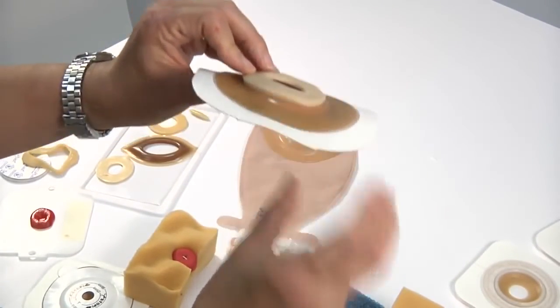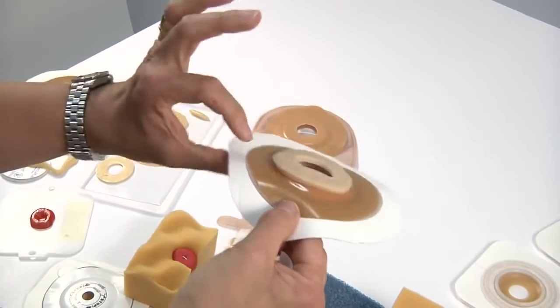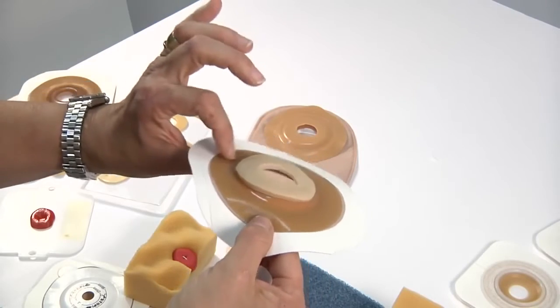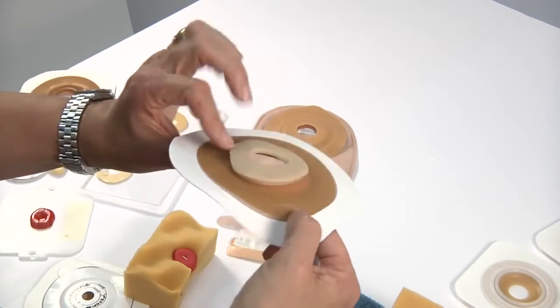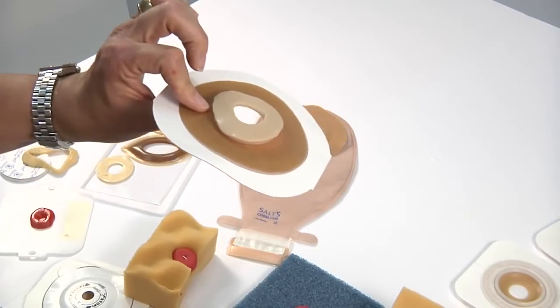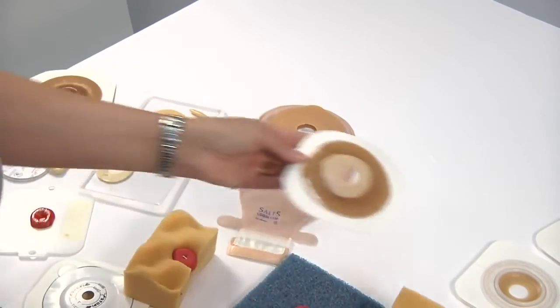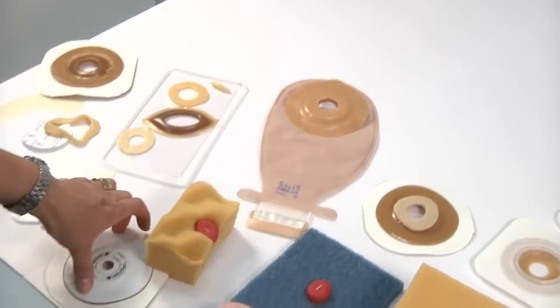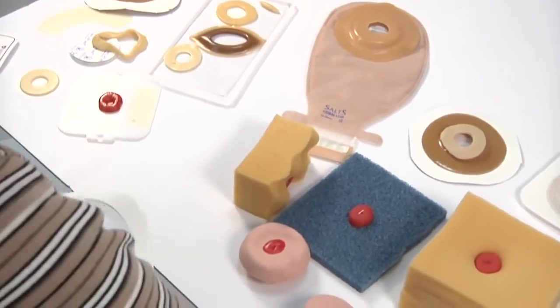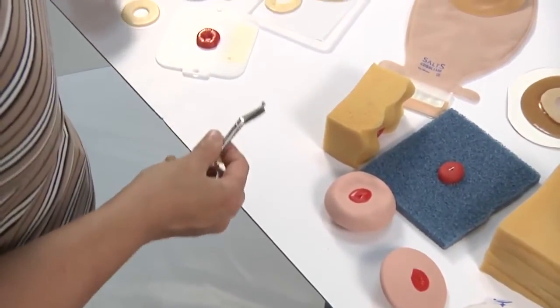Okay? As soon as you do that, though, you're adding cost, right? If you think about what the cost of a ring is and the cost of a convex barrier, you're starting to make a very expensive system, but if that's what's required to ensure a seal for the patient, then that's what's required. Okay? You have to remember that convex barriers typically add about 50% over the cost of a regular flat barrier.